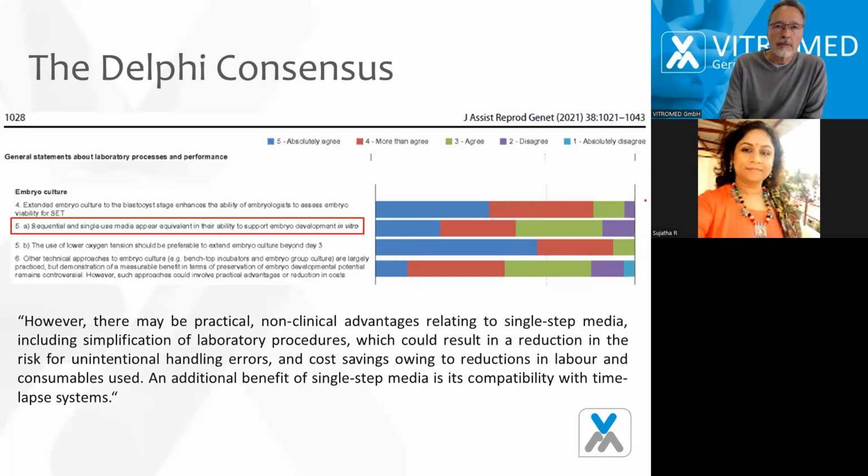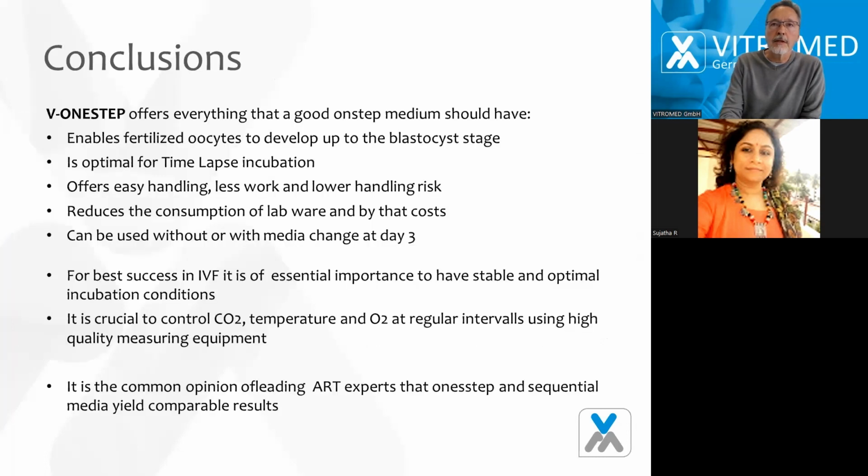And one important sentence here inside is, they also said, however, there may be practical non-clinical advantages relating to single-step media, including simplification of laboratory procedures, which could result in a reduction in the risk for unintentional handling errors, and cost savings owing to reductions in labor and consumables used. An additional benefit of single-step media is its compatibility with time-lapse systems. So I think this is convincing to me.